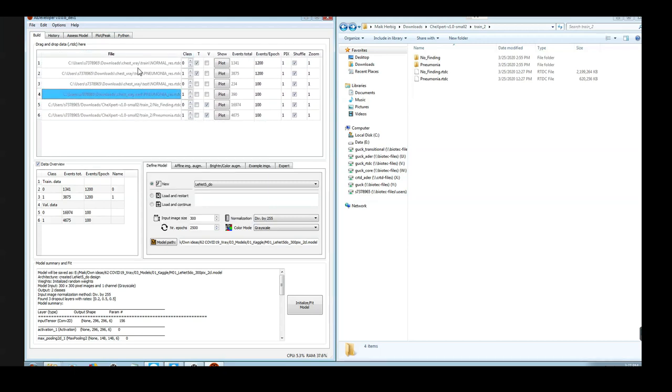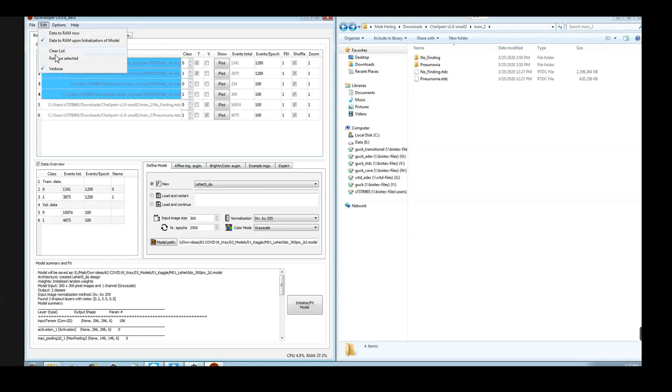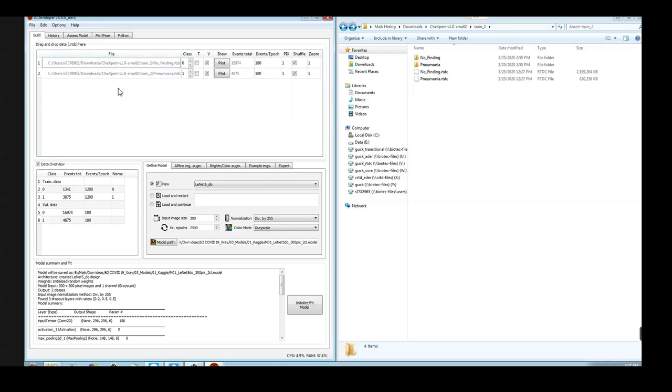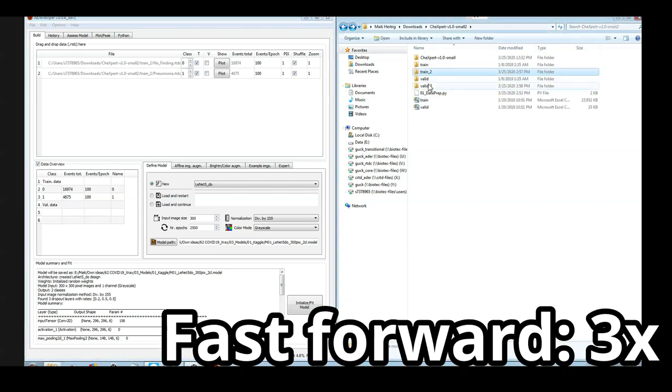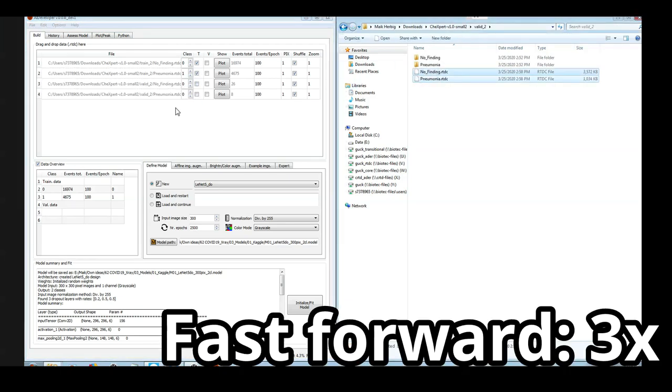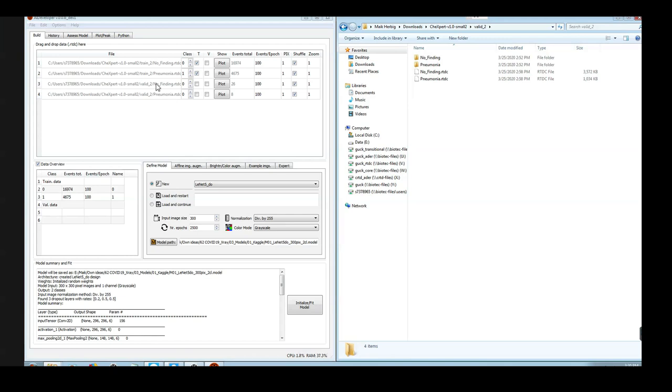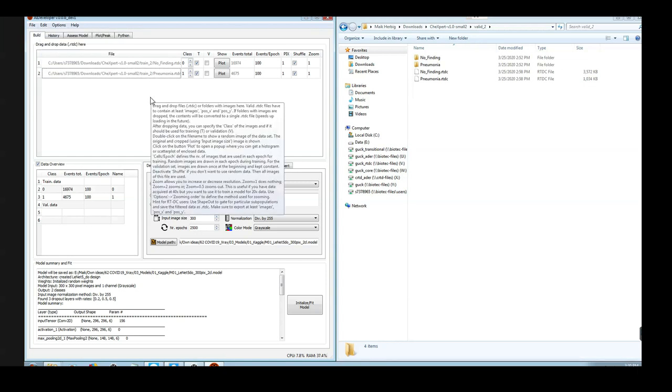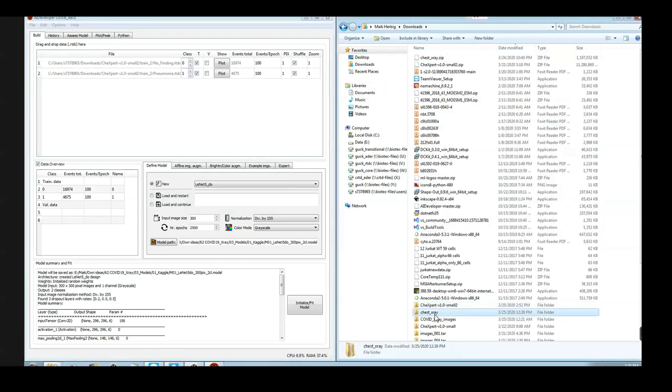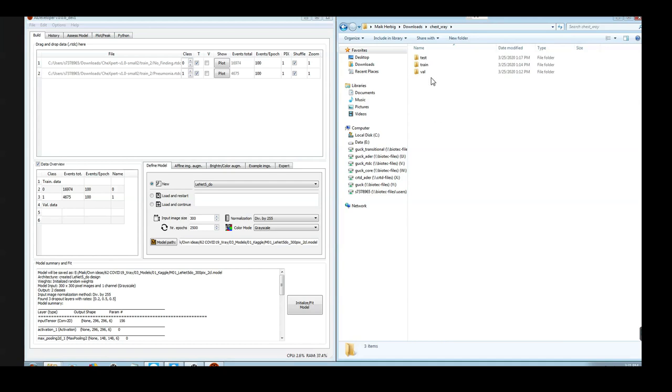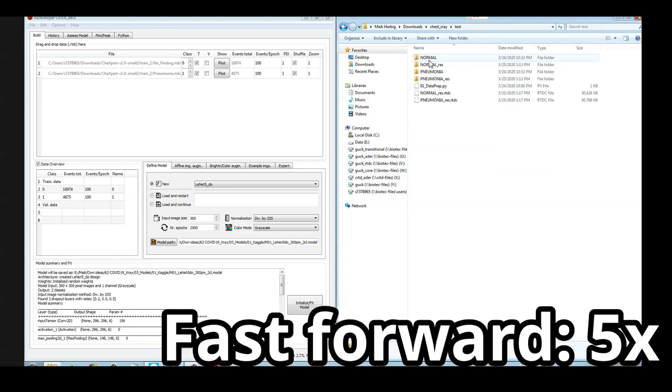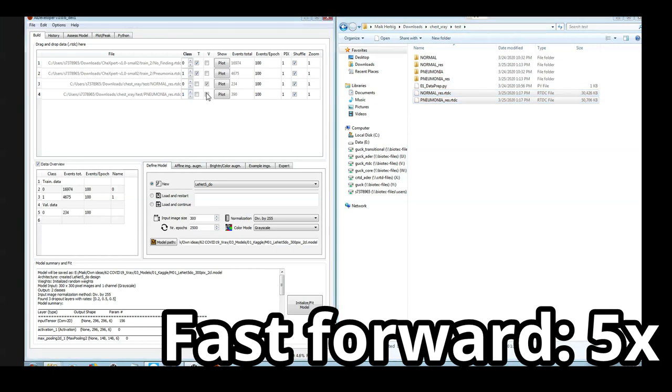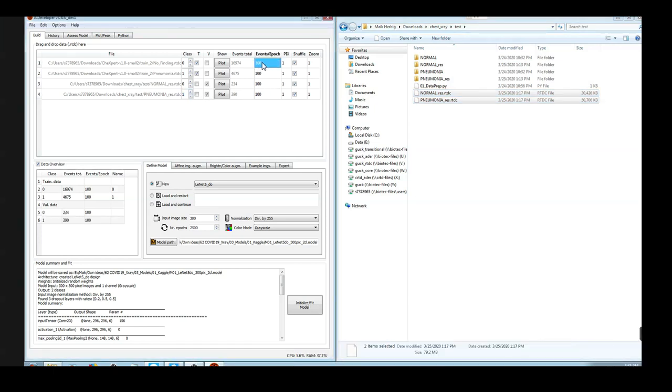First of all, we can remove the Kaggle dataset. We already inserted the training dataset for the Chexpert. Unfortunately, this validation dataset contains only very few images. Probably it is a much better idea to already use the Kaggle dataset in order to obtain the validation accuracy after each training iteration by checking against this Kaggle dataset. Therefore I would now like to remove this validation data and instead load the Kaggle dataset. Here I would like to use 4000 random images in each training iteration, and for validation 100 images are sufficient.